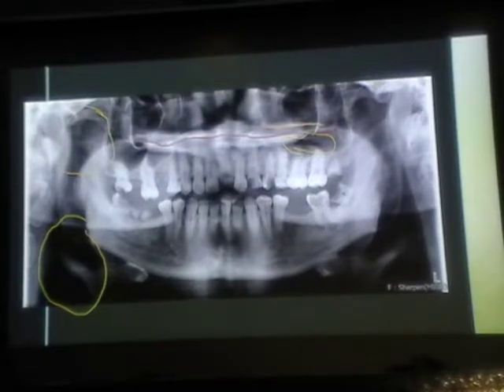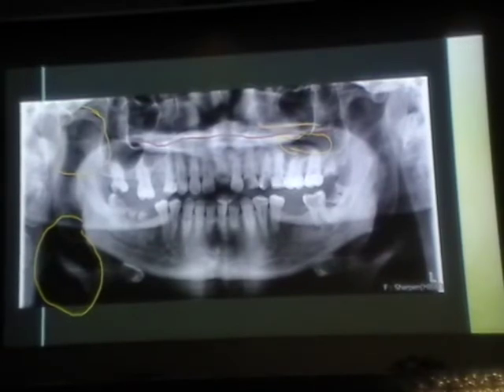Okay, so with those top two lines, the hard palate and the ghost image, the soft palate, I recall on one of your slides saying that double images occur towards the center. So wouldn't those palates be a center feature and produce a double image instead of the ghost image? So here, yes. Also, in this one, it could produce a double image. Also, it could produce a ghost image as well. Because if you follow the first slide, the structures that are in that region will cause both, like cervical vertebrae, hard palate. They also cause ghost image. So again, it depends on where exactly they are located. That's why you should be looking at where the structures are located. Look at the picture, you'll get an idea.